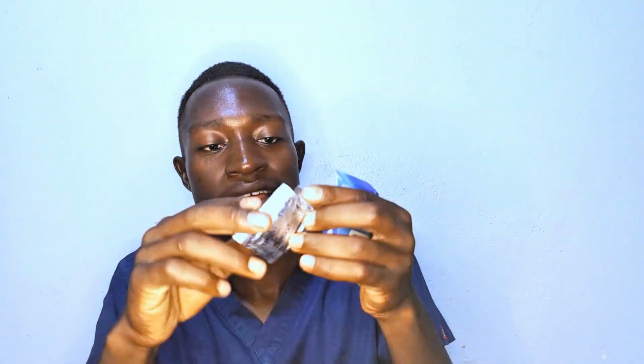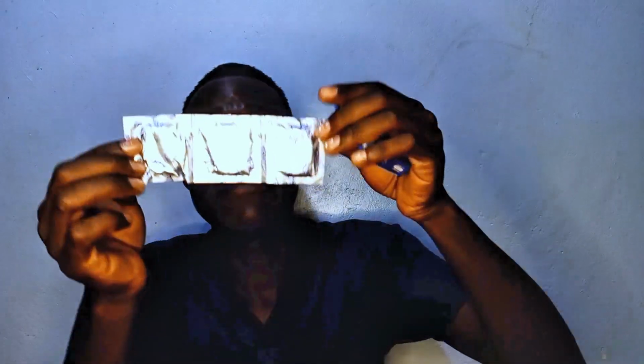So it was manufactured in May 2024 and it will expire in April 2029. So this is the place where you look. This white patch here is where they have written the expiry dates. You can also find the expiry dates written here. It is written in black. I hope you will be able to see. I don't think you will be able to see, but I'll show you how to check the expiry dates of these kinds of condoms.